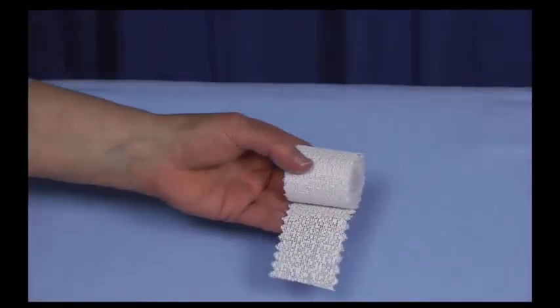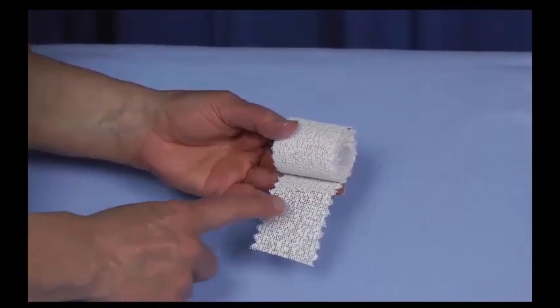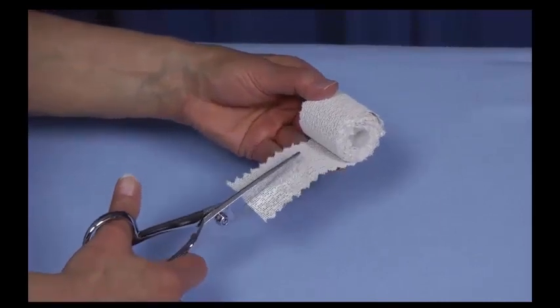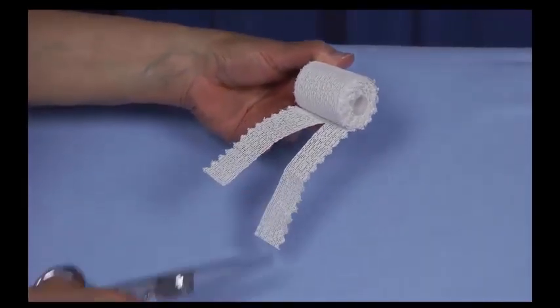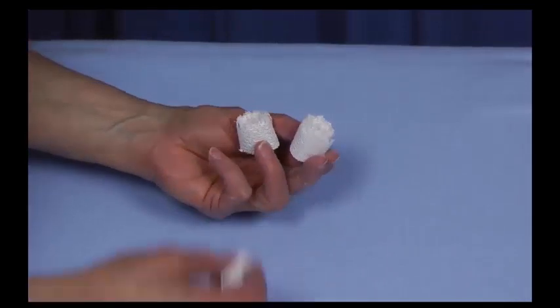We're using two-inch plaster of Paris — gypsum plaster in lino weave, which describes the mesh. We cut this two-inch width into one-inch widths, and then roll those up into small rolls. This simply makes it a lot easier to apply this very small serial cast.